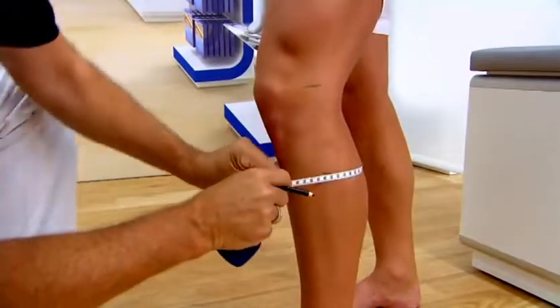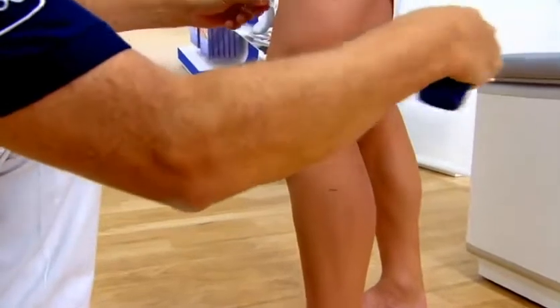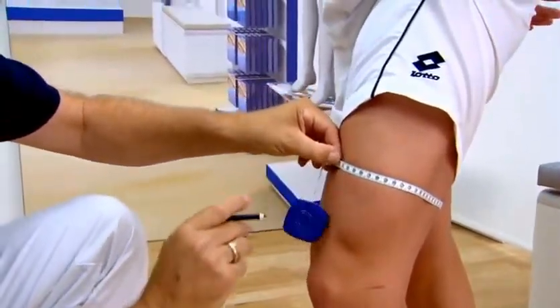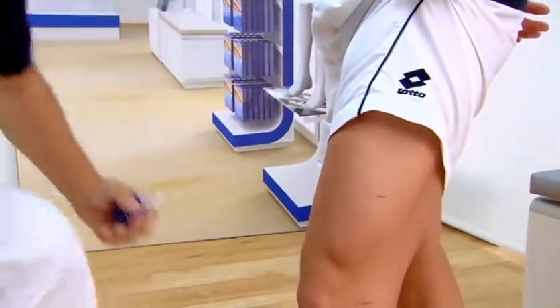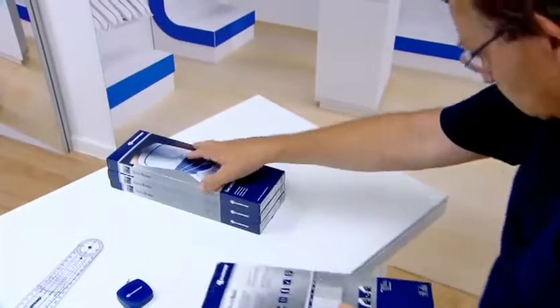Measure the circumference of the leg at these two points. The circumference measurements can be used to determine the right size of support with the help of the table on the back.